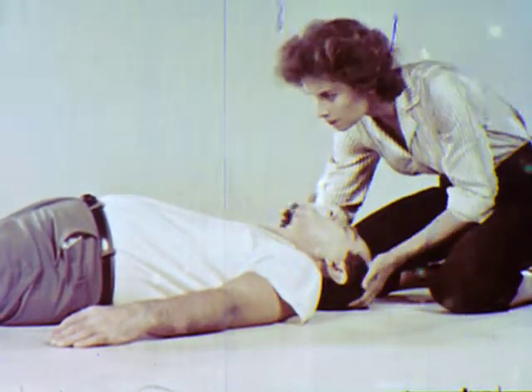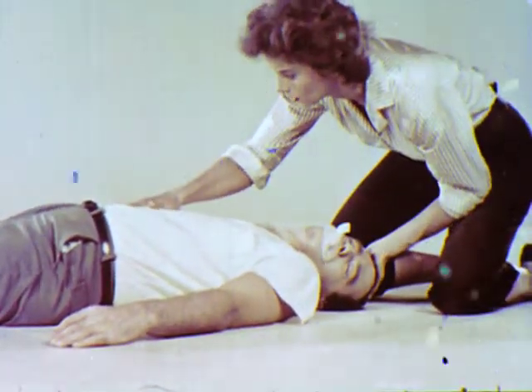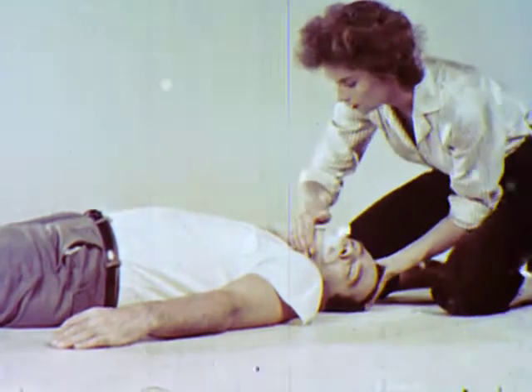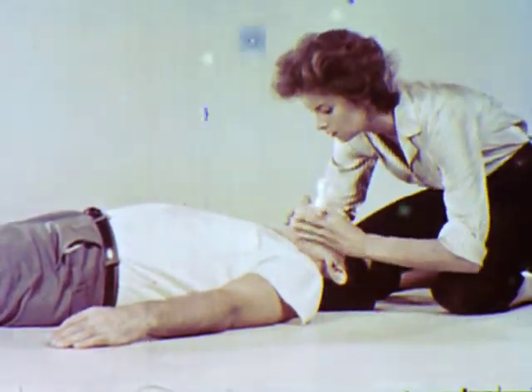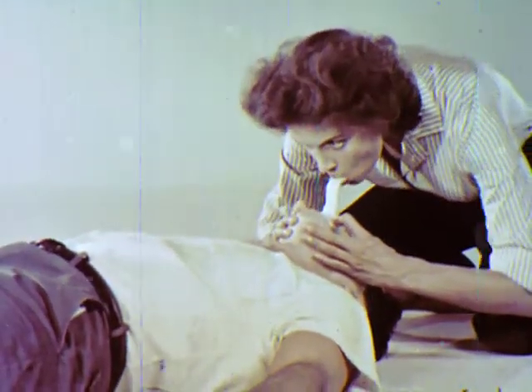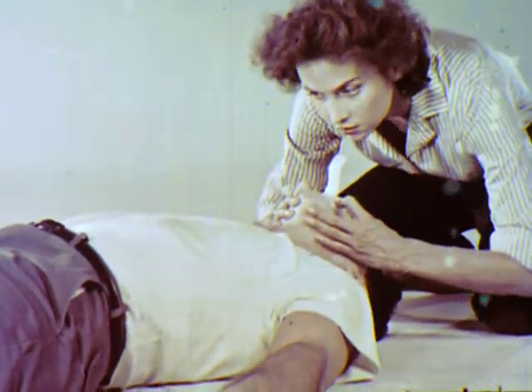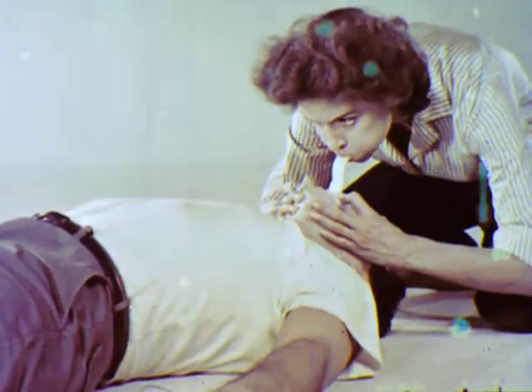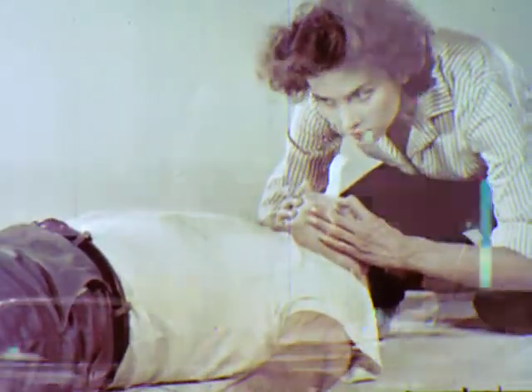If you notice the stomach bulging because of air blown into it, press on it. If vomiting occurs, clear the throat quickly. When the unconscious victim begins shallow breathing, blow in your breath at the moment he inhales. And take your mouth off the resuscit tube quickly when he exhales so as not to interfere with his natural breathing.